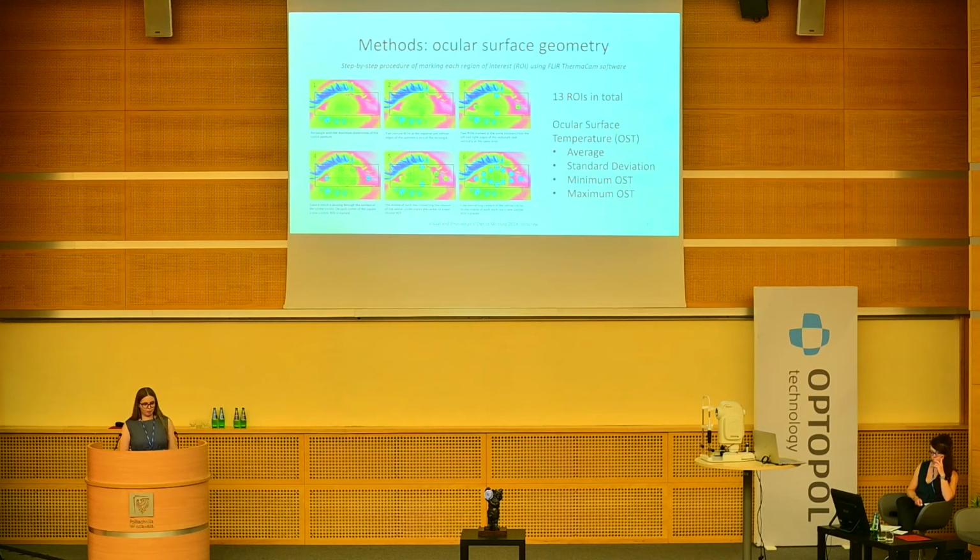And from the 10 seconds, we chose 1 hertz, so once per second, every frame that we fitted with a protocol that would accommodate all the, respect the palpebral fissure of each person, so the natural geometry of the ocular surface.